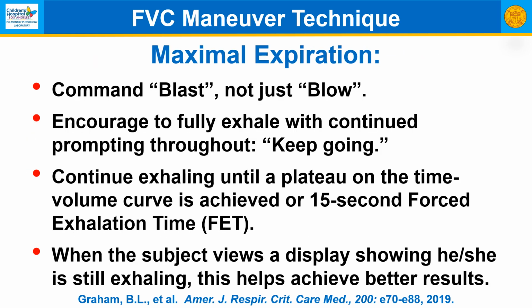The maximal expiration: the American Thoracic Society recommends the command of "blast," not just "blow." So you want to encourage a full exhalation with continued prompting throughout. Keep going, etc. Continue exhaling until a plateau on the time volume curve is achieved, or a 15-second forced expiratory time, exhalation time, is achieved.